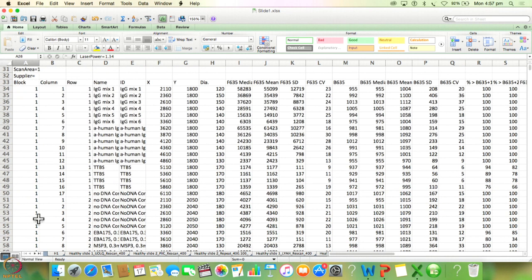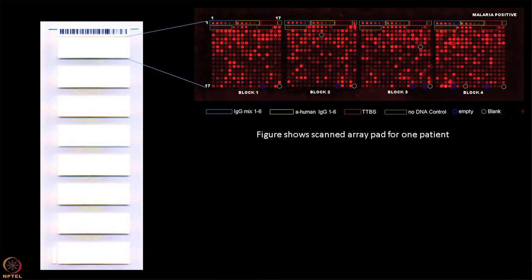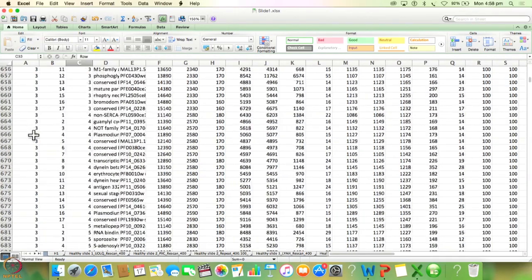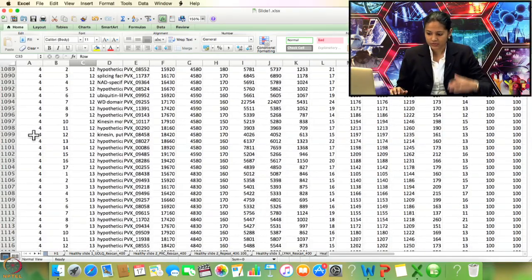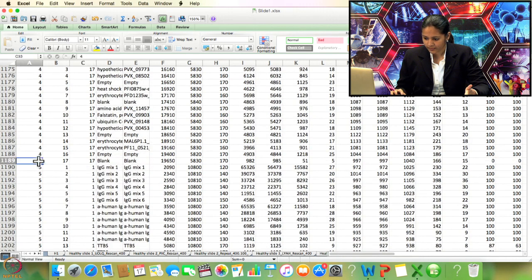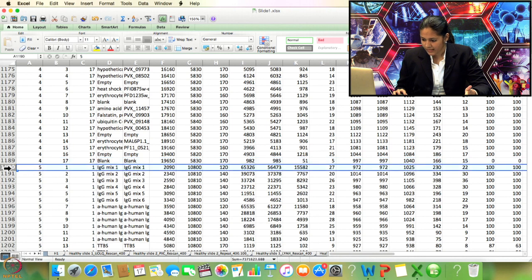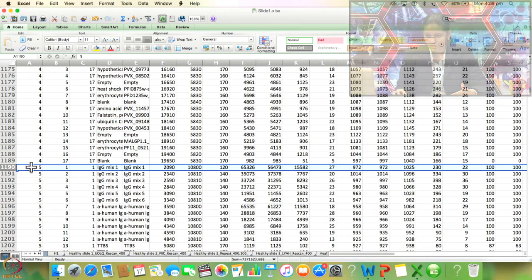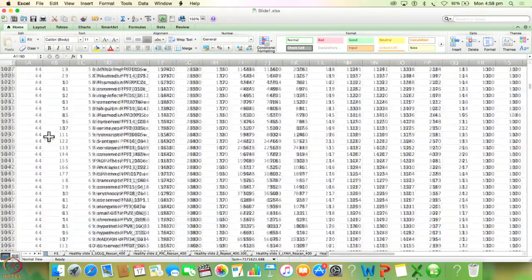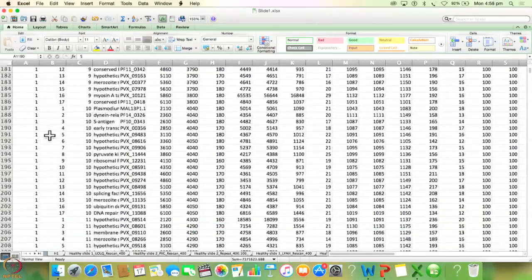Scrolling down, you see block, column, and row. This is very important. One slide probes 8 patient sera, and one pad (which probes one patient sera) has 4 blocks. Every 4 blocks represents 1 patient's data. When you scroll to block 5, a new patient begins. For example, where block 4 ends with 'blank', you will see IgG mix 1 starting again — that is your new patient. We are going to first reorganize this data.